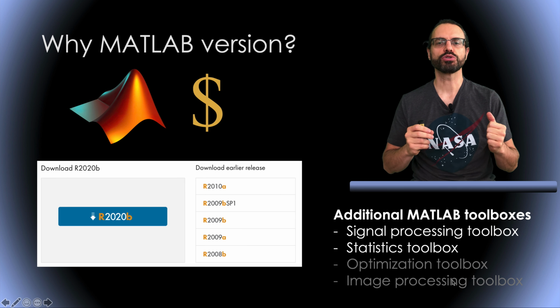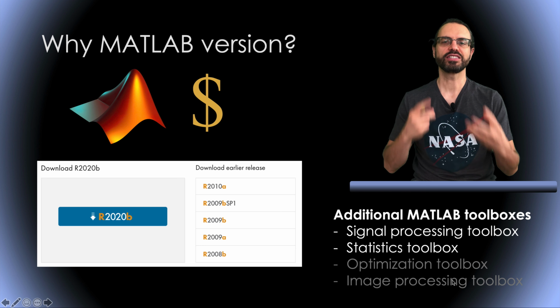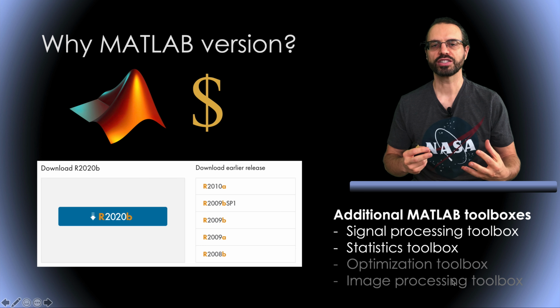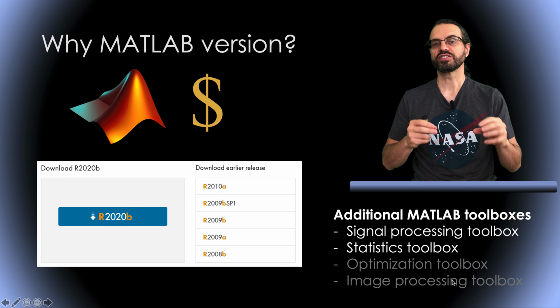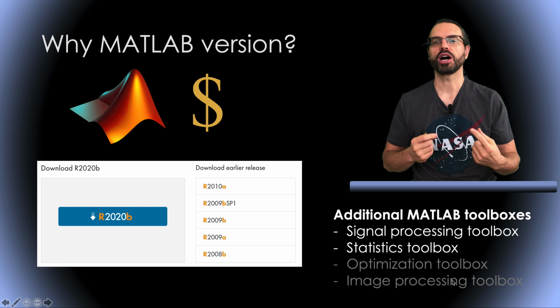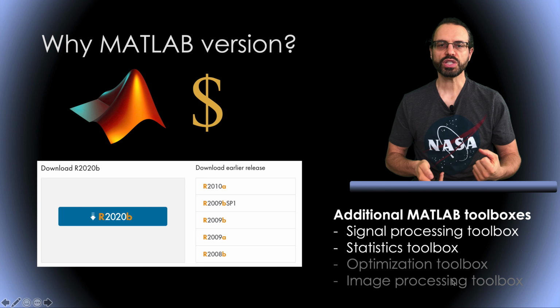In terms of additional toolboxes, we recommend the signal processing toolbox and statistics toolbox. The optimization and image processing toolboxes are also used in some rare instances. Even if you do not have any toolbox, EEGLAB will work properly. Some of the EEGLAB plugins might not be functional though.